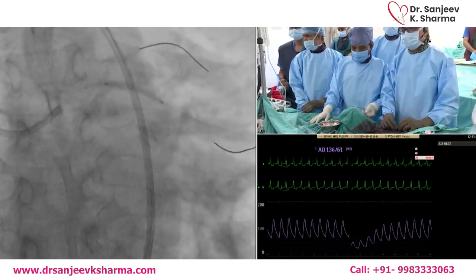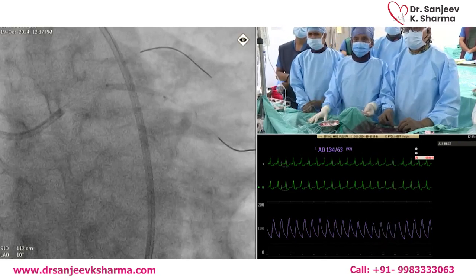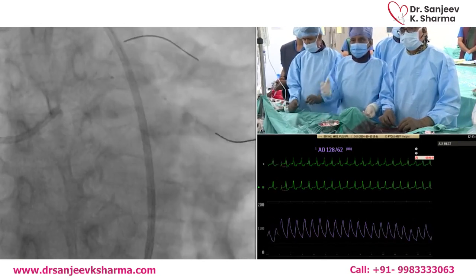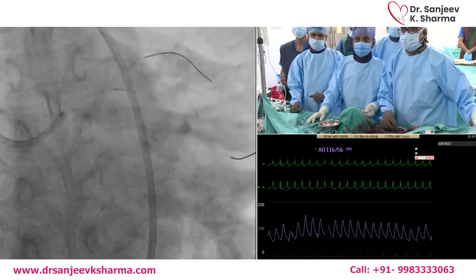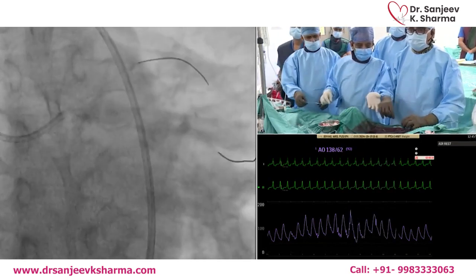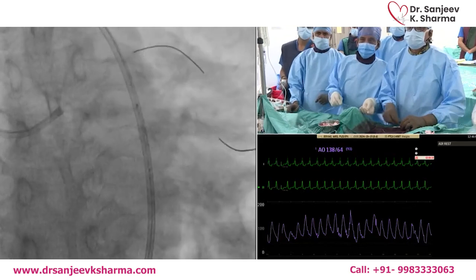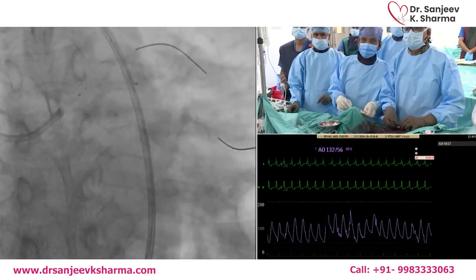But Jitendra, the point remains that even with 80,000 RPM, I have to deal with the left main the same way, like this case. If I have to do it at Mount Sinai, I'll do the same way I do for rotational atherectomy: do the orbital at 80,000 RPM, and let's open the ostium a little more. You have to open the ostium. Yeah. So the key is go 80,000 and then use a cutting balloon because of the large vessel, and particularly if there is moderate calcium.